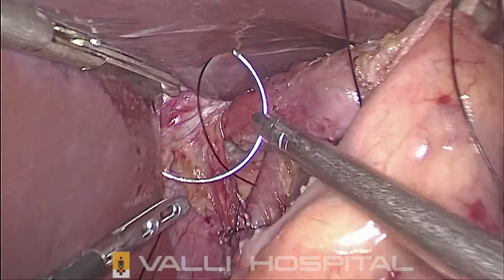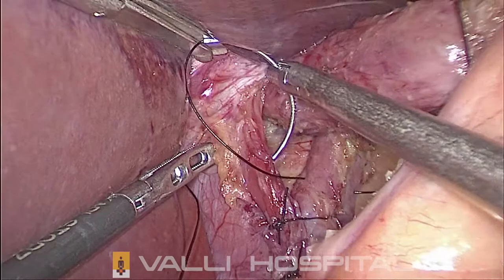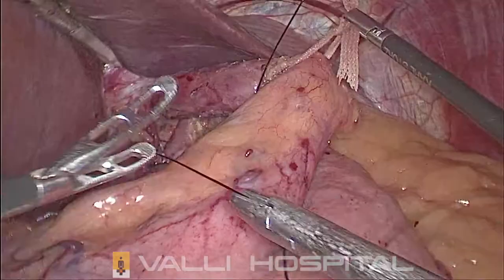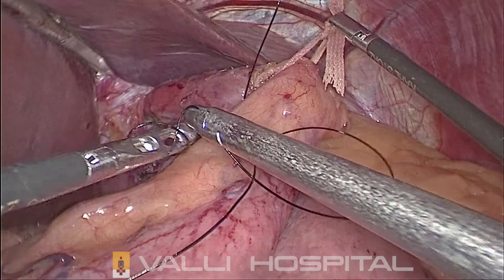See, I am protecting the aorta with the left hand. Hold the needle at a right angle, then only you can take the bite easily. See, I am taking it out horizontally. Unnecessarily, we should not injure the liver, it will start bleeding.